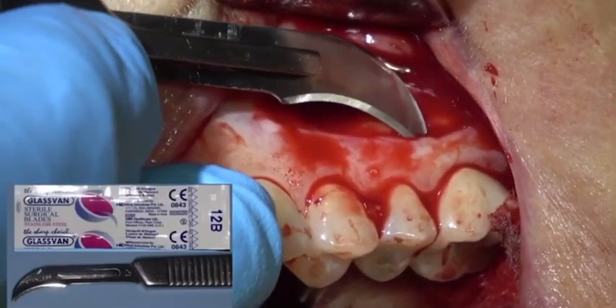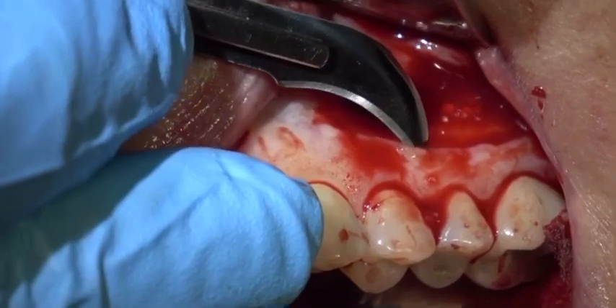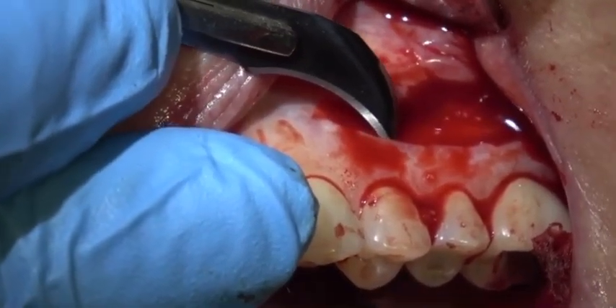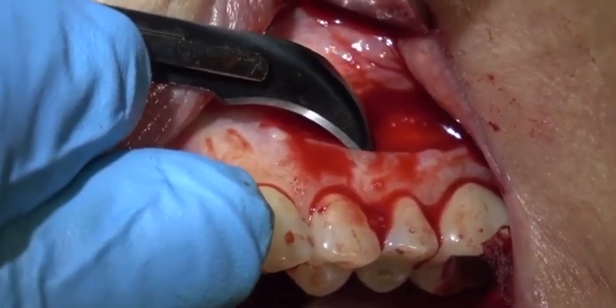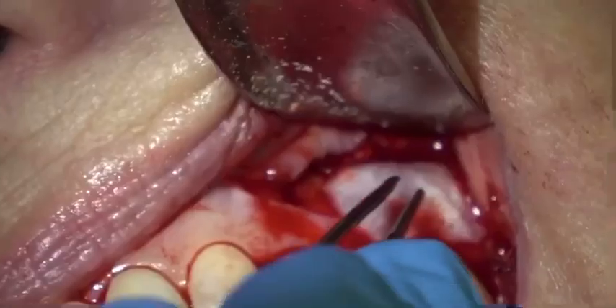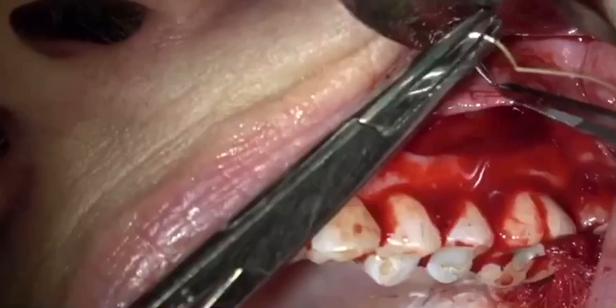This is a number 12 Bard Parker, and I'm just undermining the coronal part of the incision — if you don't, it's very difficult to suture. Then this is a Contour Adapt Resorbable Collagen Membrane; I'm trimming that and cutting the corners off — it's just easier to place. Placing that over the bone graft and being sure my flap is free.